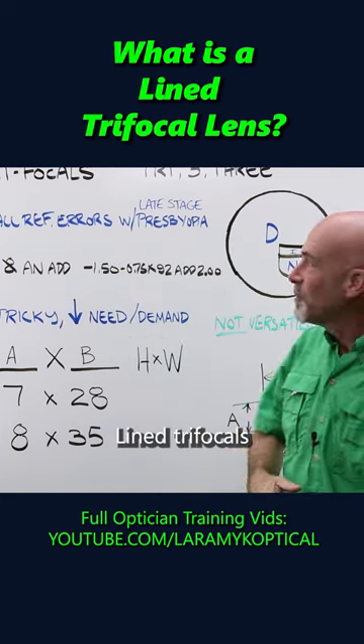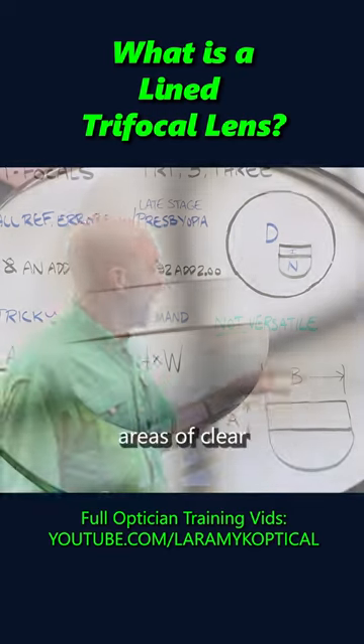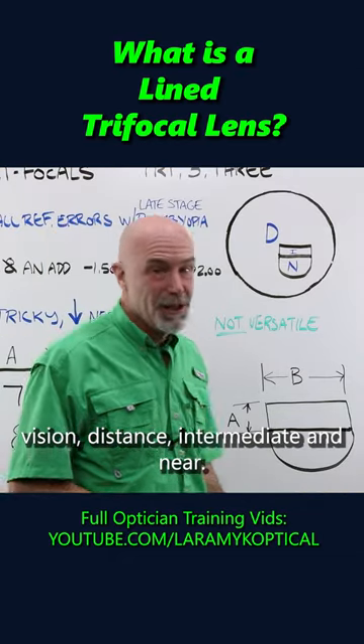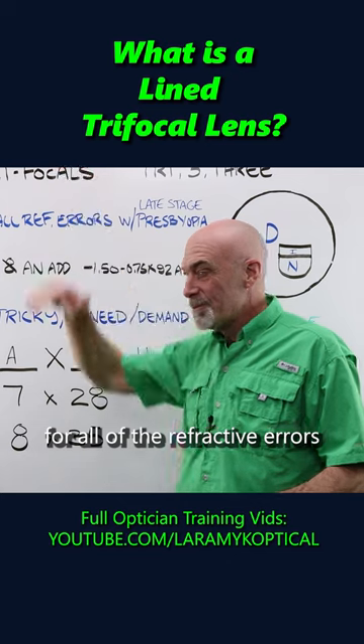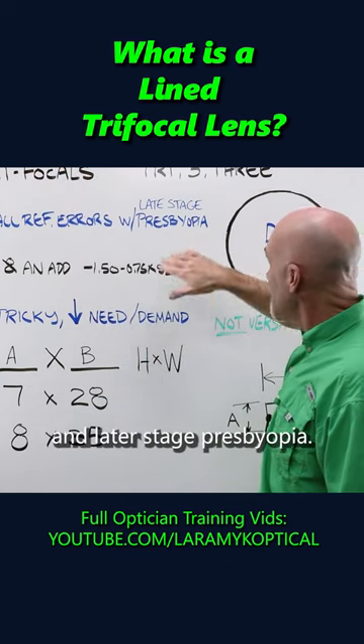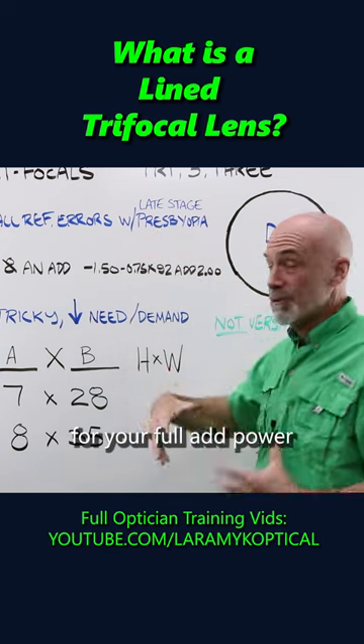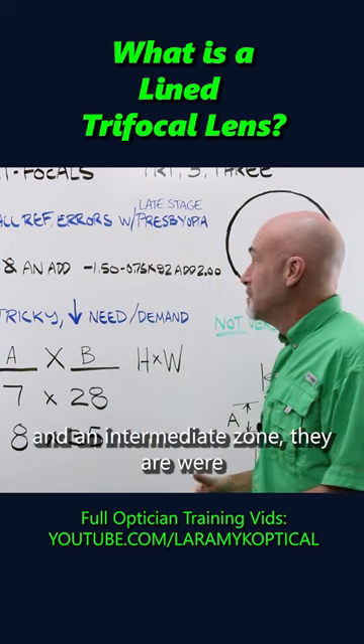Lined trifocals have three distinct areas of clear vision: distance, intermediate, and near. They correct for all of the refractive errors and later-stage presbyopia, when you have that desperate need for your full add power and an intermediate zone.